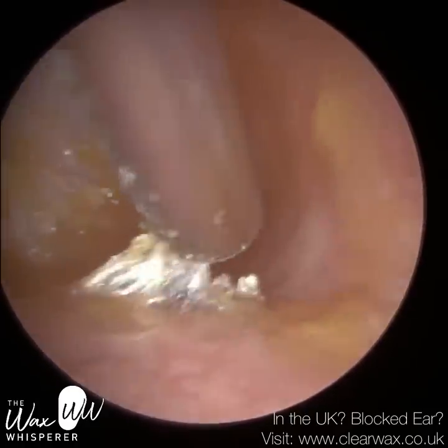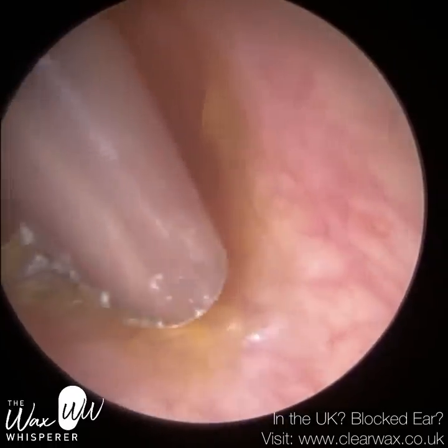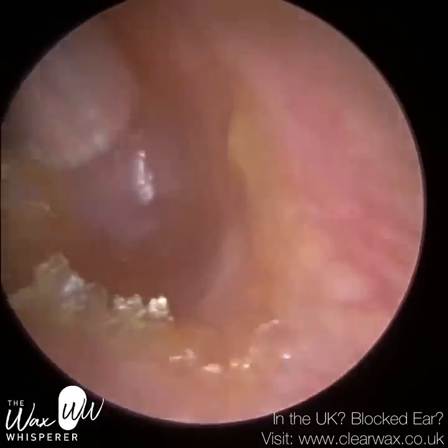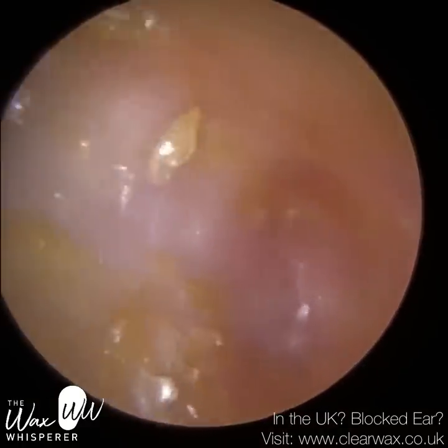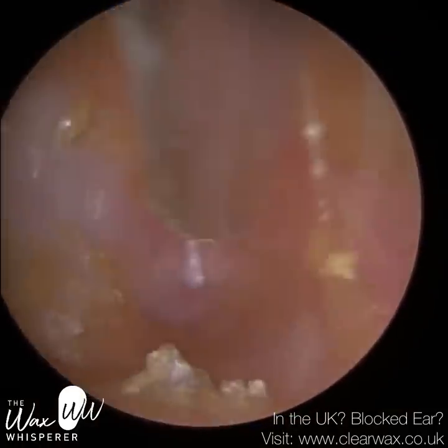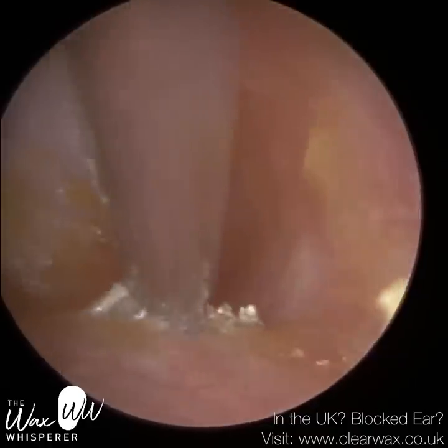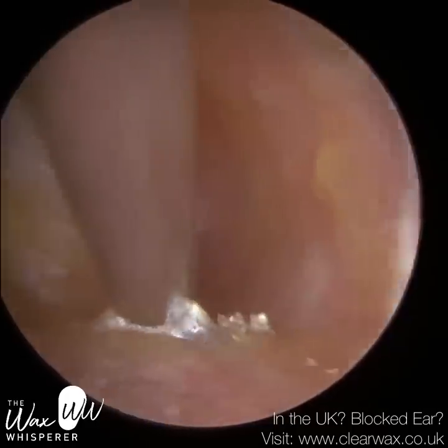So the false fundus, you can see it there in the distance, that very pinky layer of skin. You can't see any of the eardrum because it's concealed behind this formation of fibrous tissue. So what I'm doing now, the patient can hear significantly less, and this can cause a hearing loss. The patient does wear hearing aids, so the development of this false fundus has caused a hearing loss.